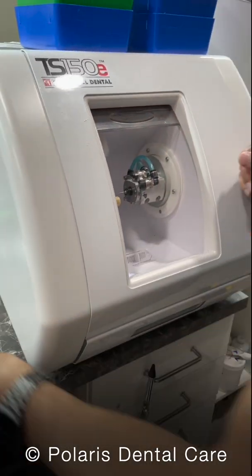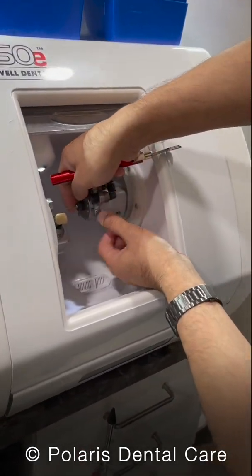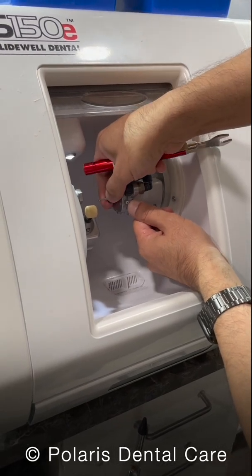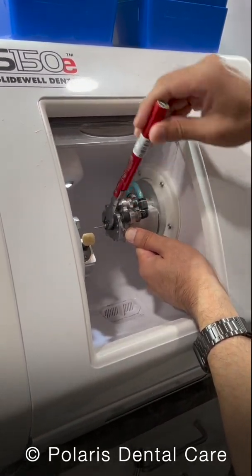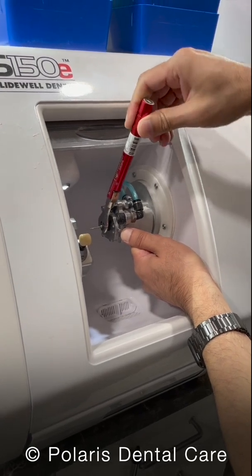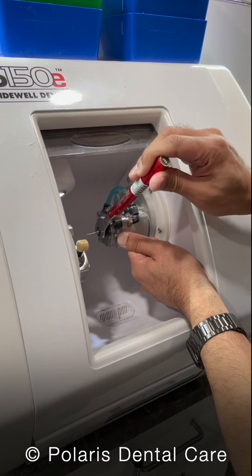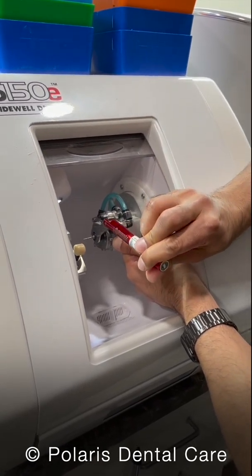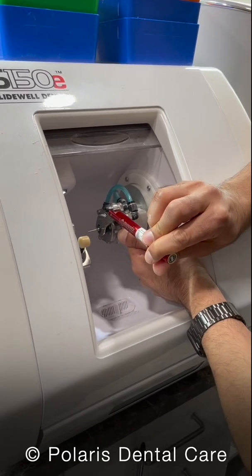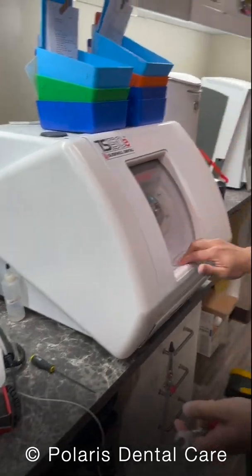Now here's where you want your breakaway wrench. Hold it on the end, hold that with your thumb until it's locked, and keep your thumb on that button. As I turn this, when it's at the appropriate torque, this wrench will actually start to bend downwards. That's how you know you're done. Once it starts to bend, you can stop. Now the burr is in place.